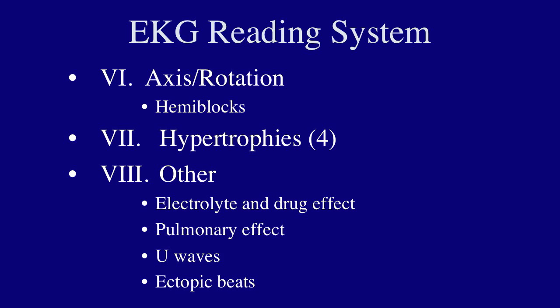Is there any kind of pulmonary effect, either acute or chronic? For example, low voltage. Do you have U waves? Do you have ectopic beats? Ectopic beats would be things like PVCs. So you go through and read all that kind of stuff as far as other or miscellaneous items.